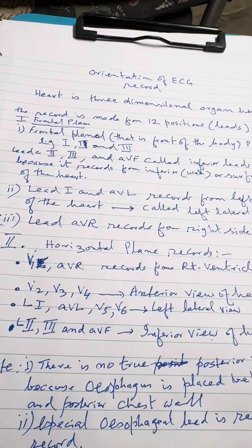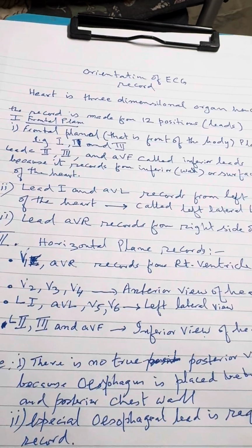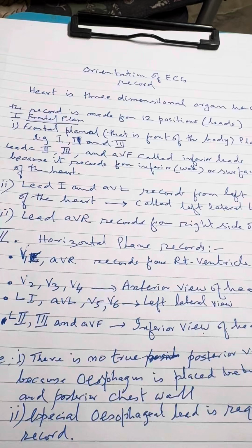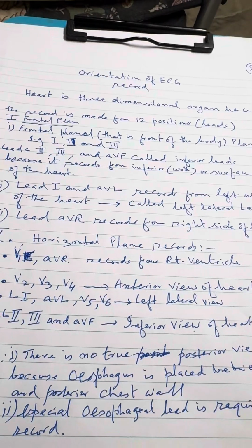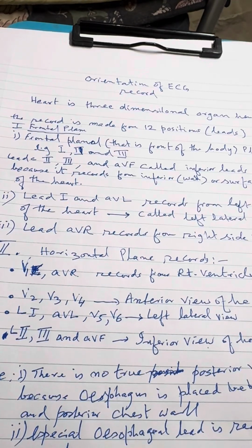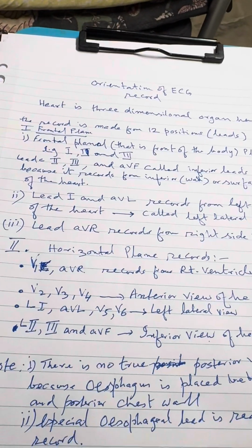V1 and AVR from right ventricle, V2, V3, V4 anterior view of the heart, lead 1, AVL, V5, V6 from the lateral side of the heart.